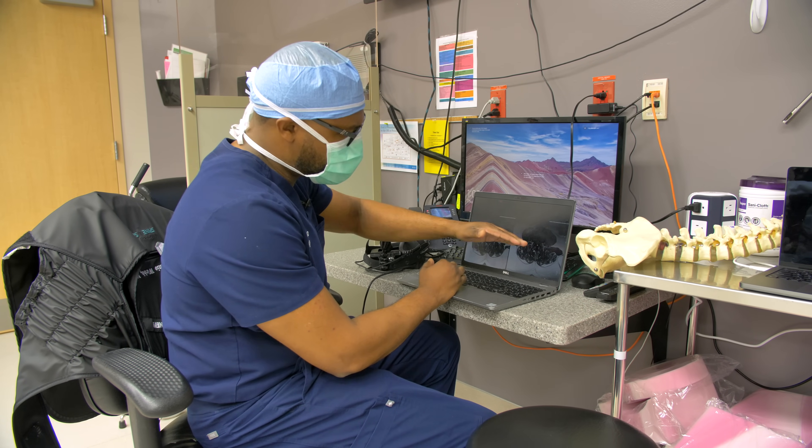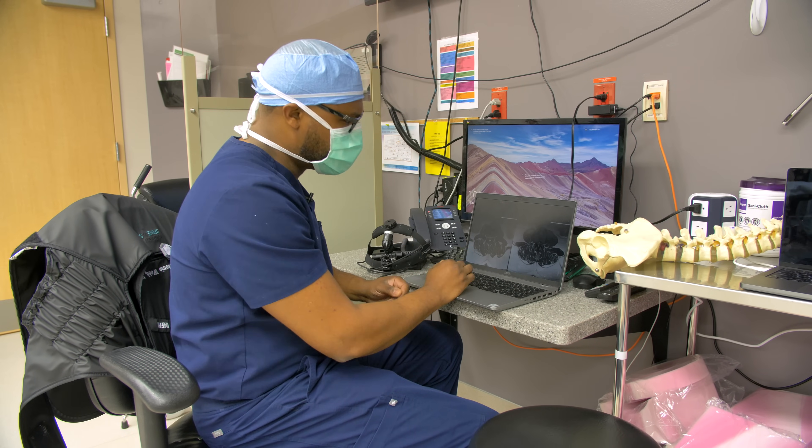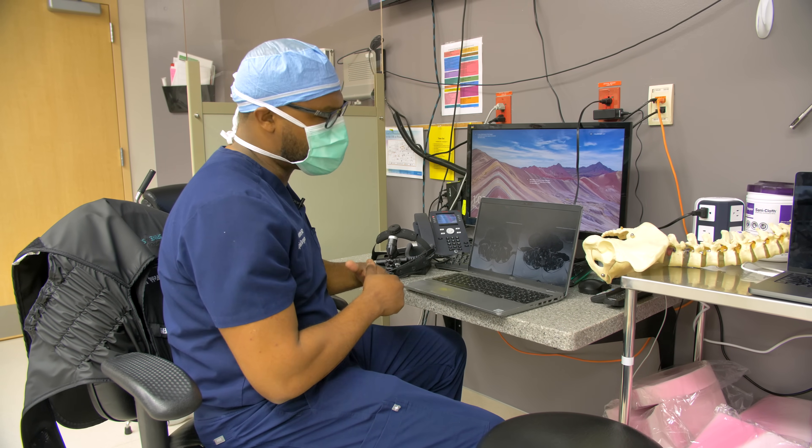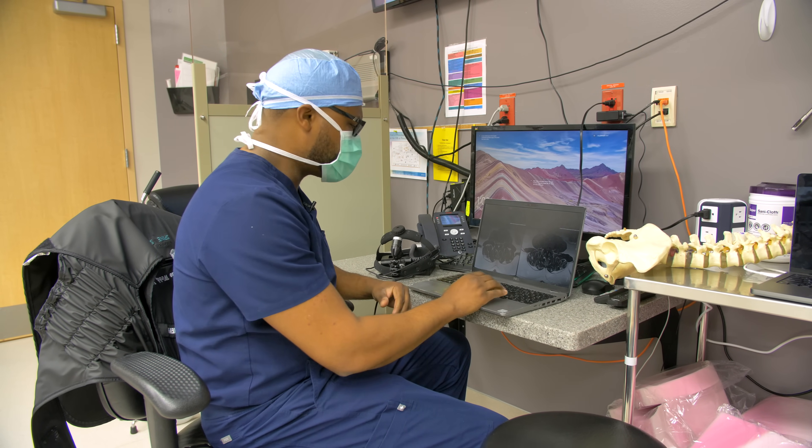The goal is to place a cage and spacer to open up the disc space, elevate it, then turn the patient over and percutaneously place a couple of screws in the back.